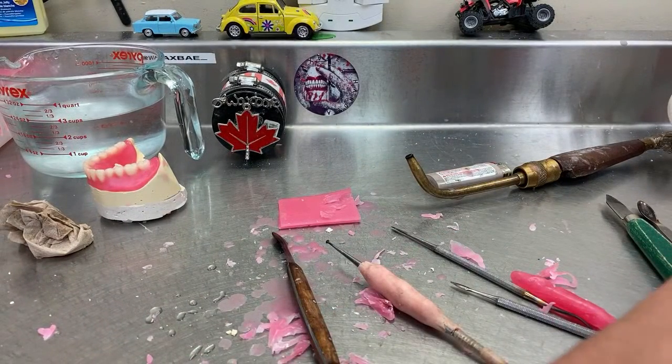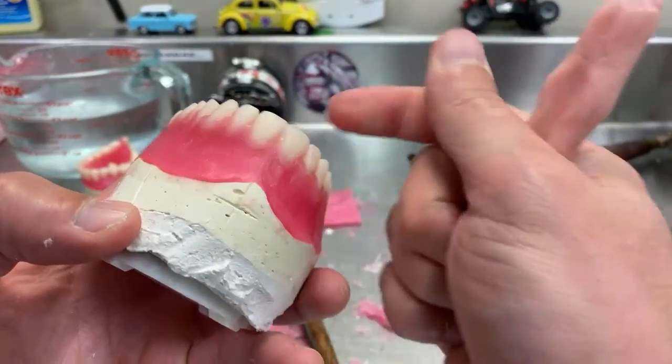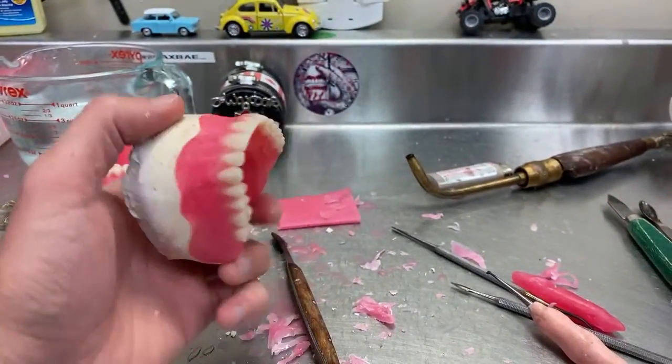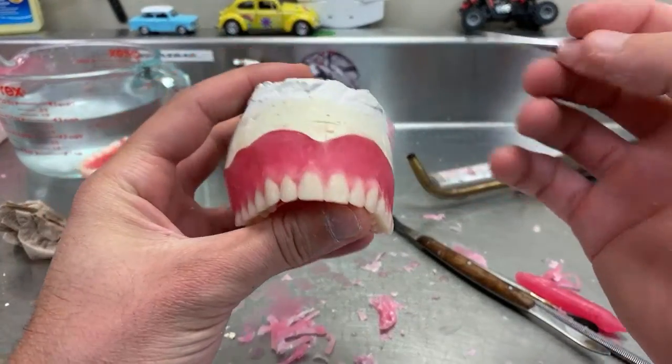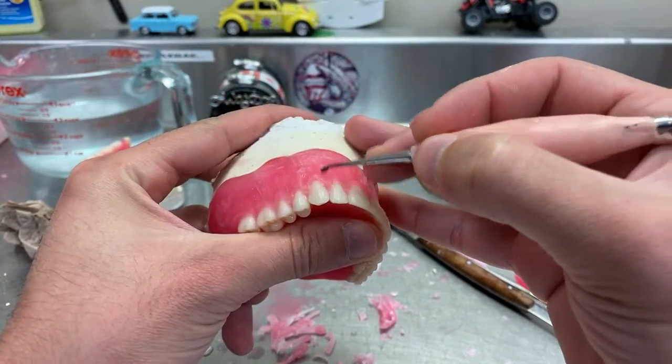Always get rid of that carving wax that you have here, because when you heat up, it may actually change it for you. And now just minor detailing on this, we see wherever it's needed.